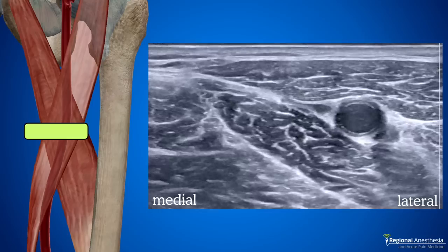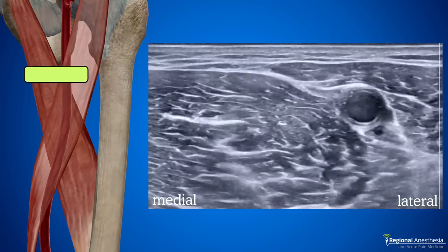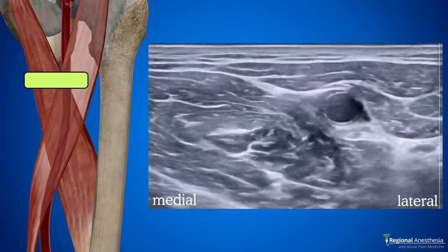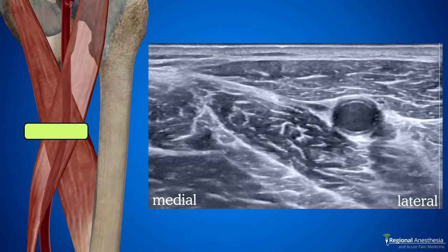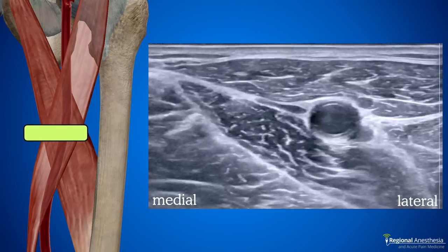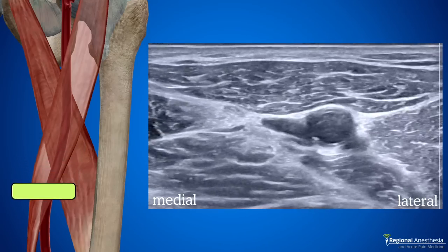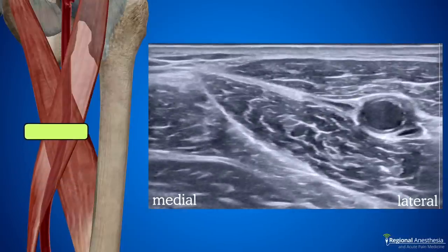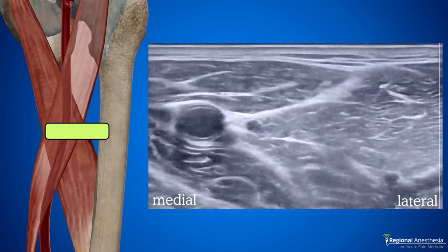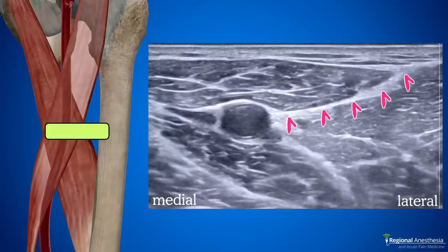If we travel north with the probe, the adductor longus muscle becomes more prominent and the sartorius muscle appears to slide laterally off the artery. You don't want to block too proximal or you'll start to get more motor fibers that end up with quad weakness. In contrast, if we slide back the other way, adductor longus disappears. Too far down and the two nerves deviate from one another and your block may not work as well. So I'll usually start at the midpoint of the thigh, verify that I'm more or less at the apex, then move lateral and fine-tune my position until I have a clear view of the plane between sartorius and vastus medialis. It's this plane that I want to target with my needle.